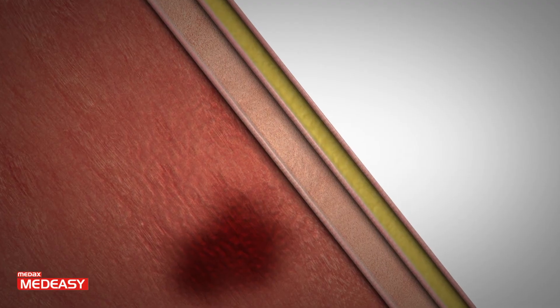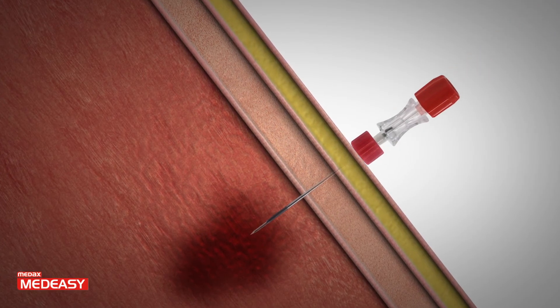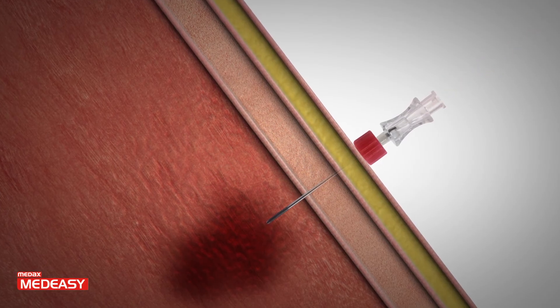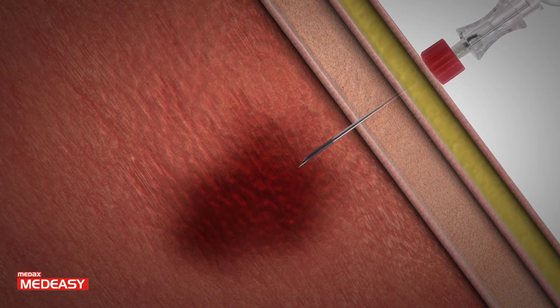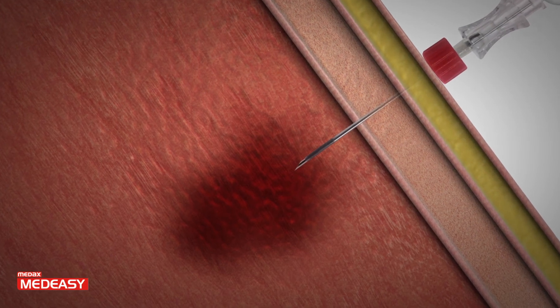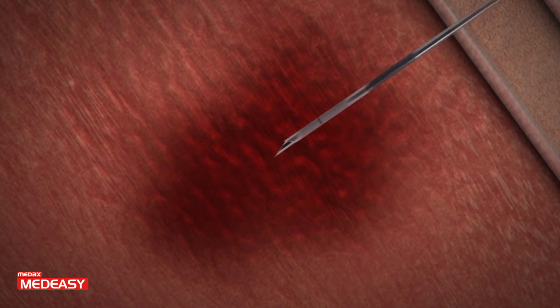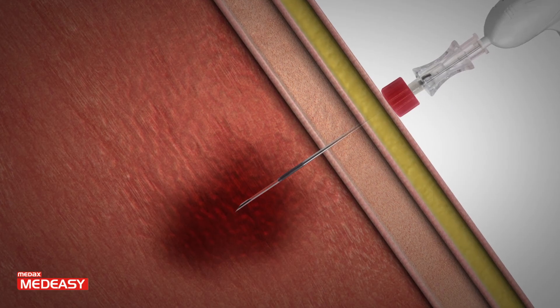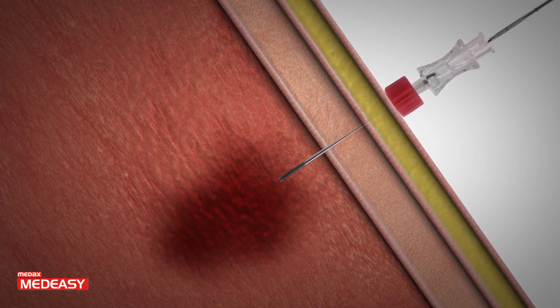A coaxial introducer needle can be used for multiple biopsies. First, place the coaxial introducer needle to reach the target area and remove the trocar tip. Introduce the loaded MedEasy biopsy needle through the coaxial cannula and activate the device to cut and collect the sample. If more samples are requested, insert the loaded MedEasy into the coaxial cannula and repeat the procedure.